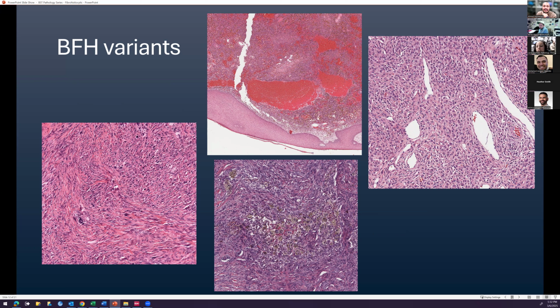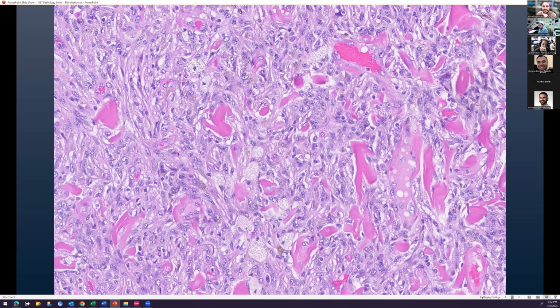And those tumors are often ALK rearranged. So I kind of think about it as its own tumor almost. But yeah, you can see how it's very epithelioid looking. I think here's another example from my own archives of the ALK type.